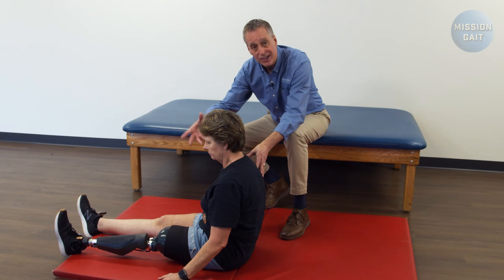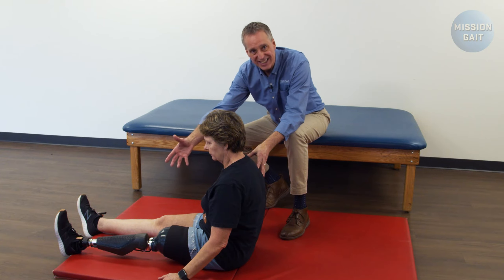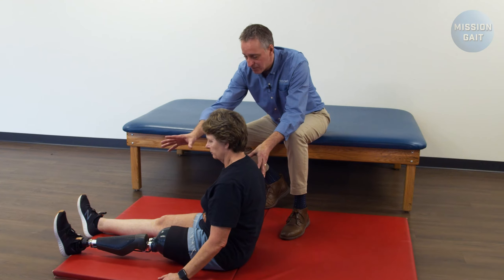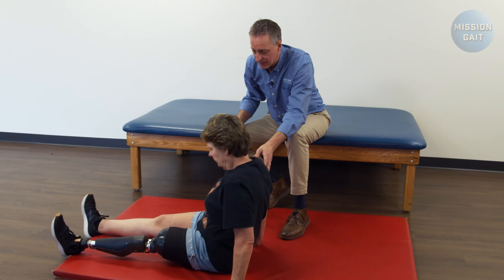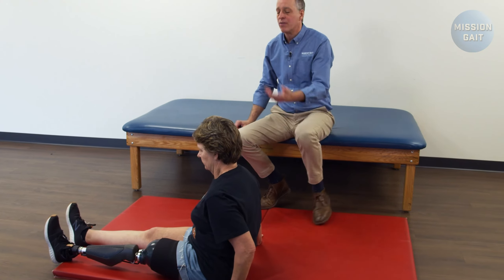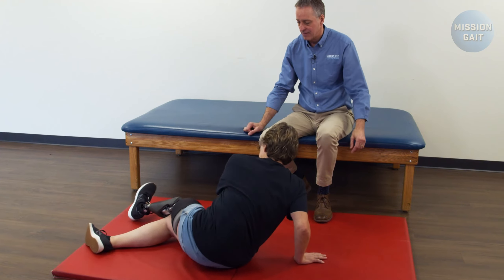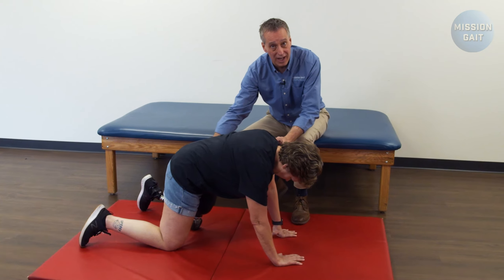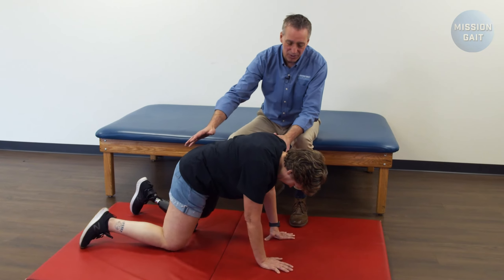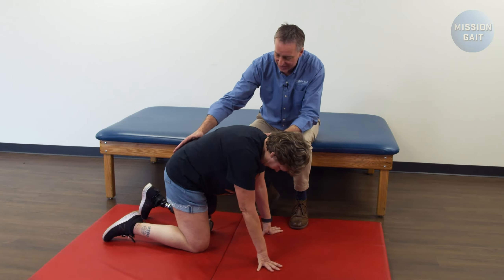If it's broken, you're going to need help — let people know you're going to need help and likely a wheelchair, because there's going to be nothing to stand on when you get up. But if we're in this position, we look pretty good. Cross your prosthetic over top of your other leg and then roll over onto your hands and knees. If you don't cross your legs first and you roll over, a lot of times your feet are crossed up behind you and it's very hard to get up.